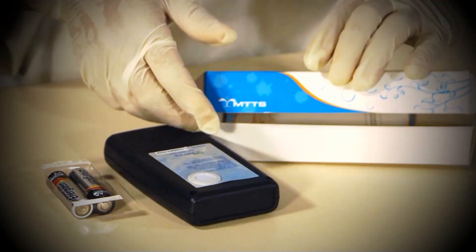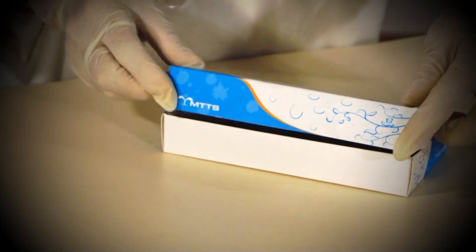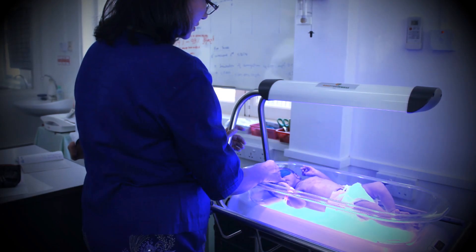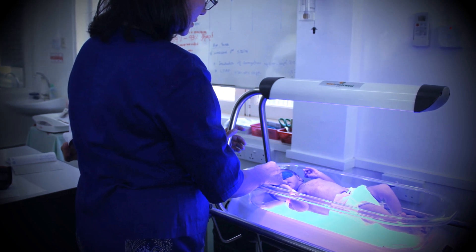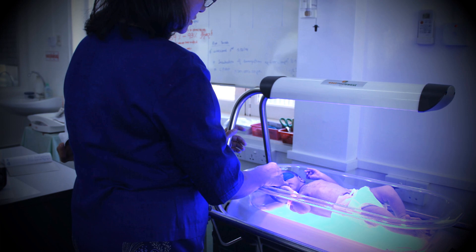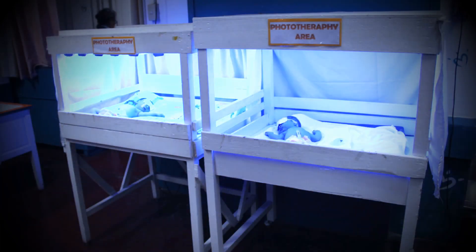In addition to helping you ensure that a baby is receiving phototherapy treatment of adequate intensity, the light meter can also help you determine when a phototherapy device or its bulbs need to be replaced. A light meter can also be used as a tool for clinical decision making. Since more intense phototherapy treats jaundice more quickly, it is important that infants with the most severe conditions are treated with the strongest phototherapy machine available. The light meter will allow you to determine which available machines are providing the strongest therapy.